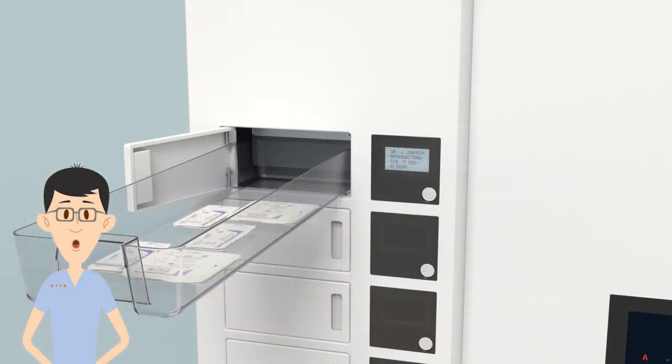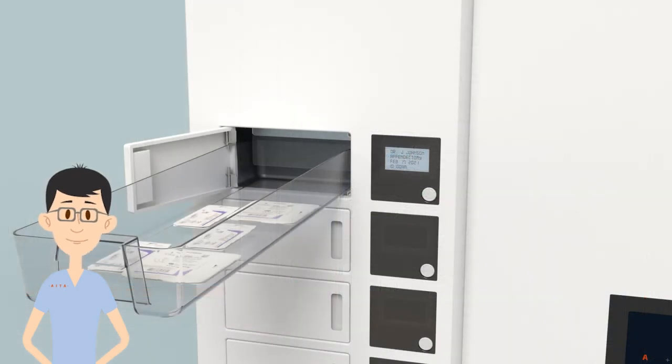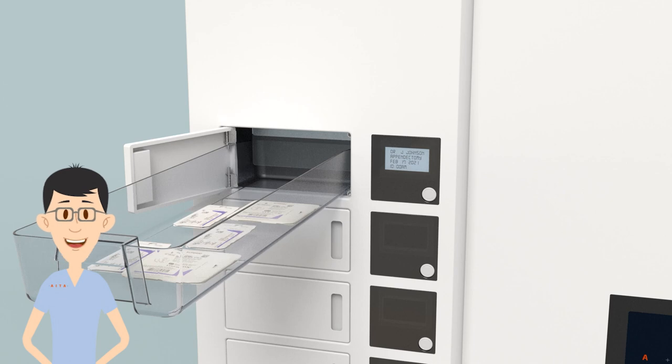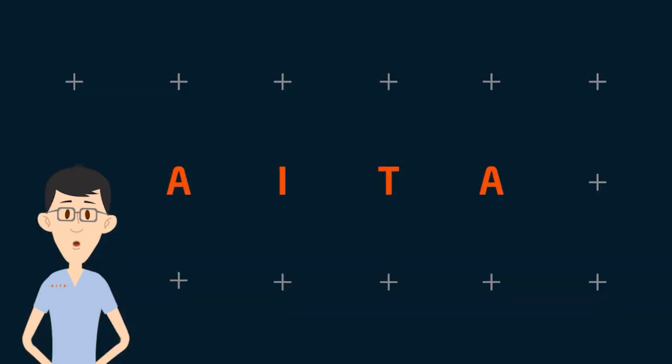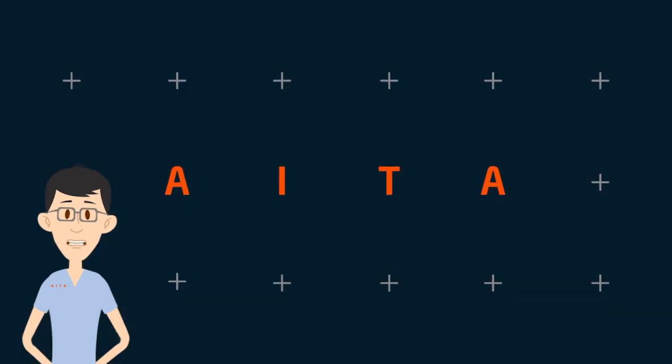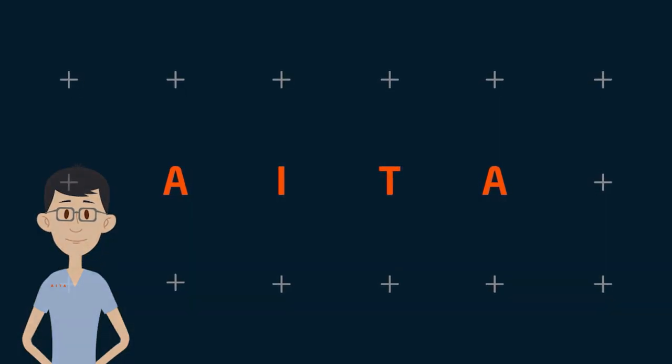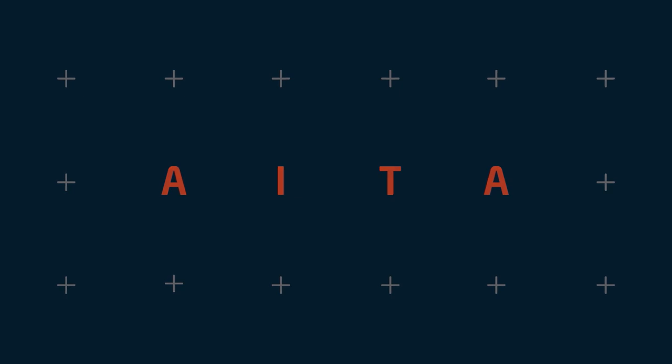Check all product dispensed by the kiosk for package integrity, correct SKU, and expiry before using in a procedure.